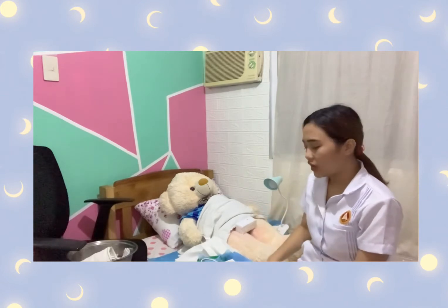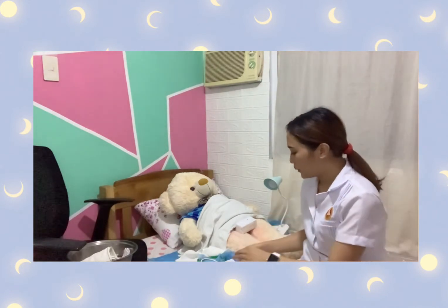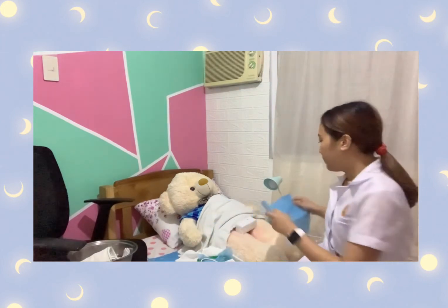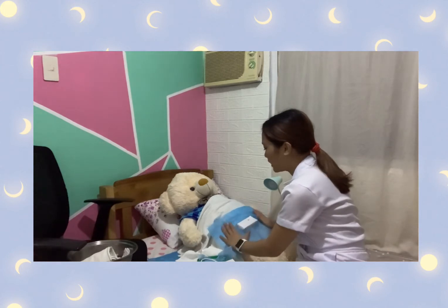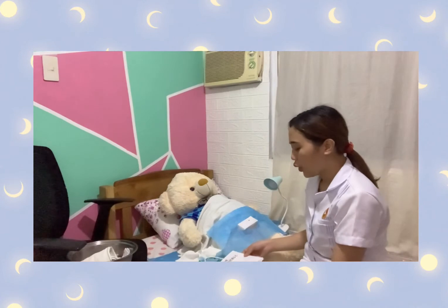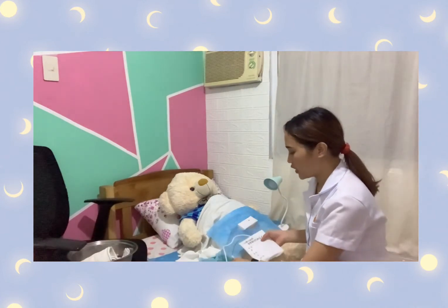And then, we need to make sure that after opening it, we can now put on gloves if they are available. And then, we will put the sterile drape onto our patient. After putting on the sterile drape, now is the time for us to open other equipment that is on the sterile catheterization tray.